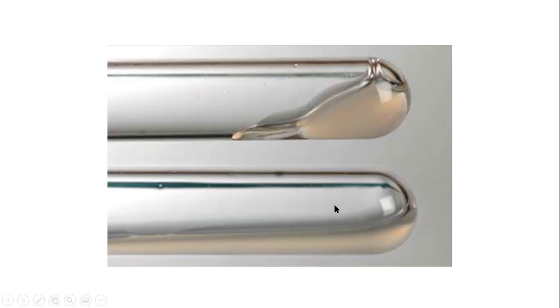On the other hand, the tube at the bottom shows no clotting at all, since the plasma is still liquefied. So that would be a prolonged APTT for the bottom tube, which means the clot did not form successfully, and that means there might be something wrong with the intrinsic coagulation pathway of the patient.